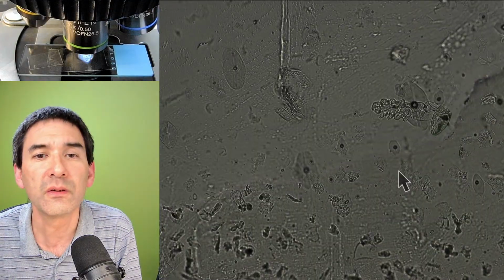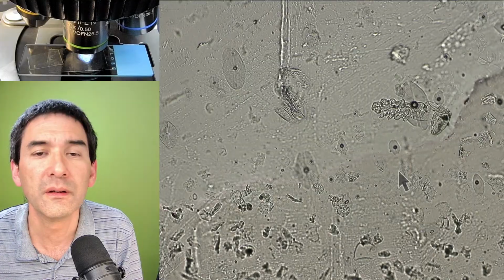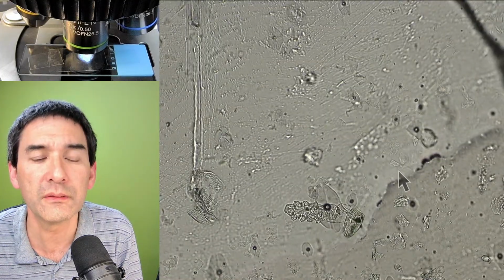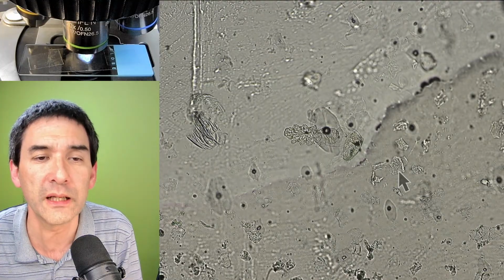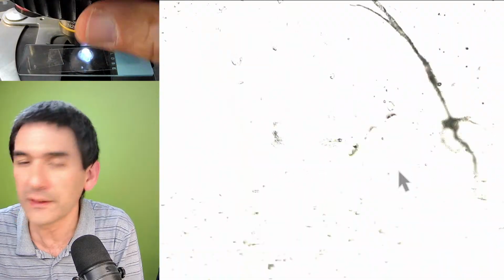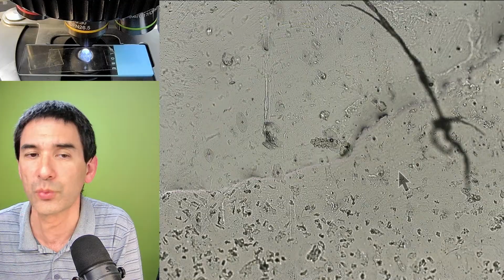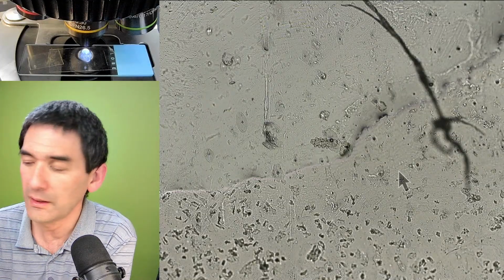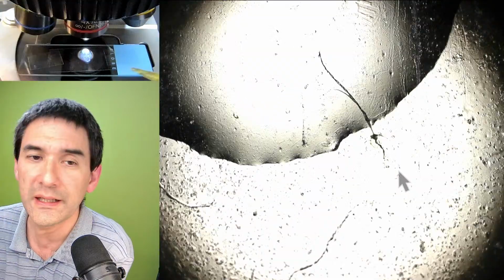Yes. Okay. So this one is a little bit unfortunate, but this one is not alive anymore. It looks pretty transparent. But maybe I'm still able to remove it somehow, simply to illustrate how this works. And what I have to do now is use the pipette again.